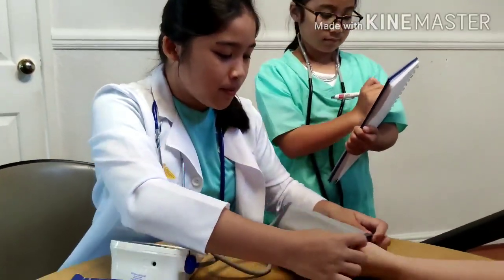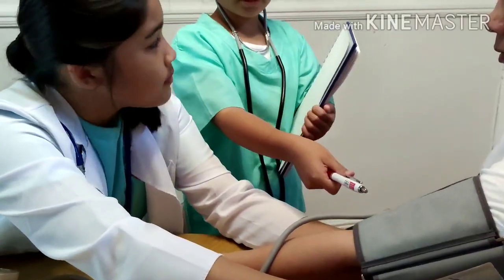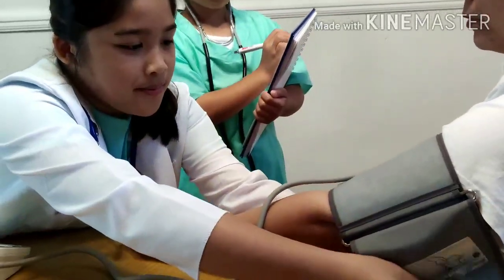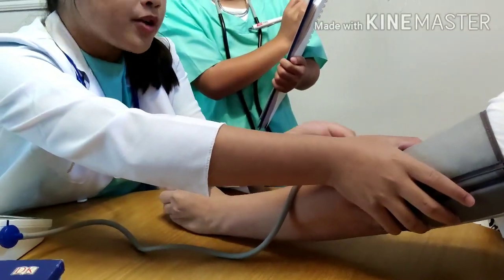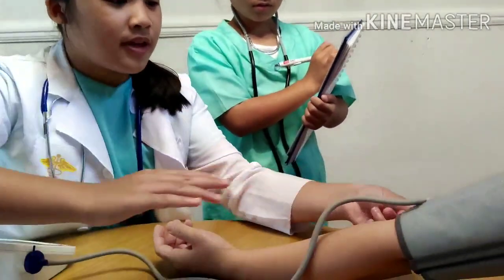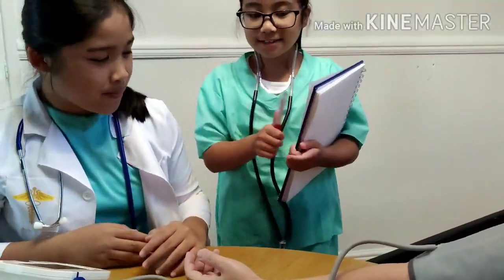The cuff should go on the patient's upper arm, like this. Make sure this arrow is pointing downwards. And now you're going to tighten it onto the patient's arm. Also, make sure your two fingers are fitted underneath the cuff, to make sure the cuff isn't too tight on the patient's arm.